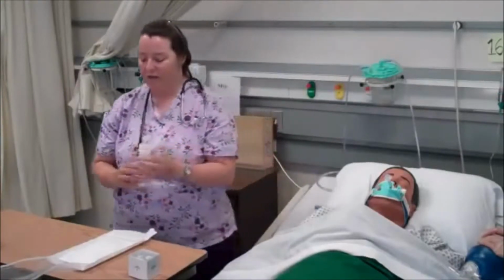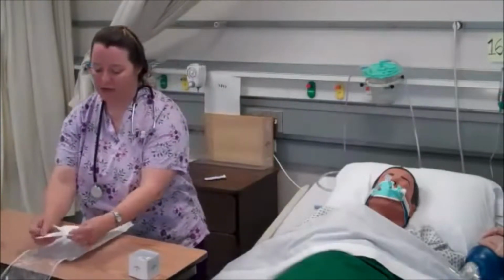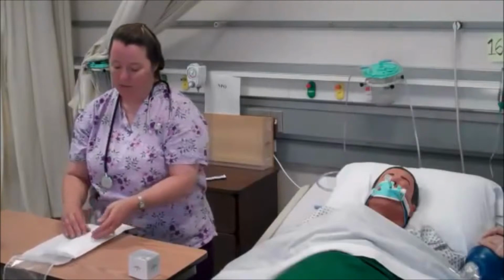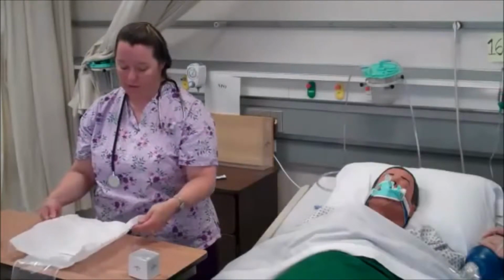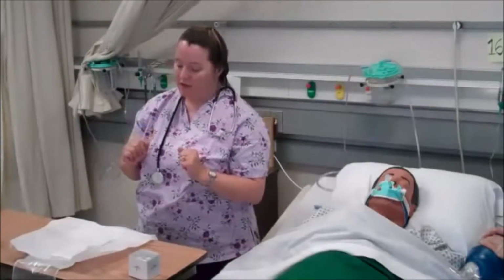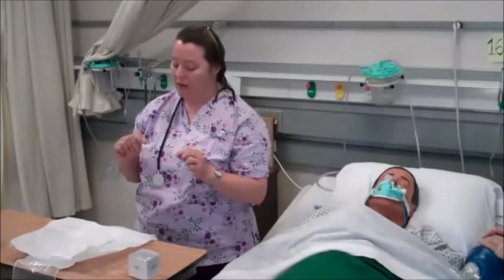Get my saline ready. And now I can open up my catheter kit here. Again, I'm going to uncrimp those edges so it doesn't pop back on me. I'm going to make sure I'm only touching that outer inch to support the sterility of the equipment that's inside here. These gloves inside are sterile. They are not labeled right or left, but I am going to glove my dominant hand first.